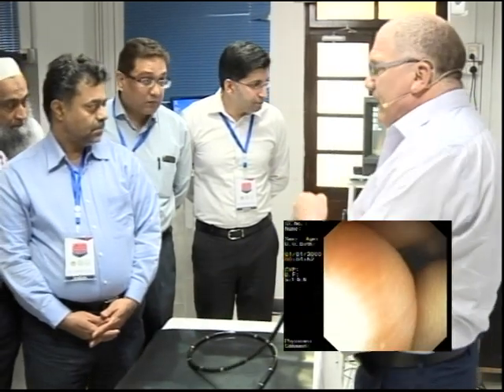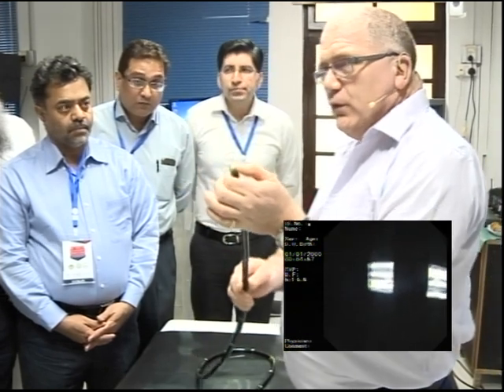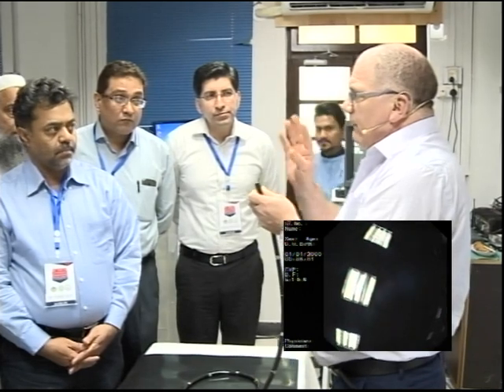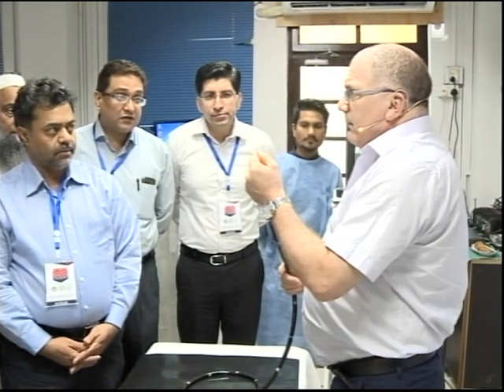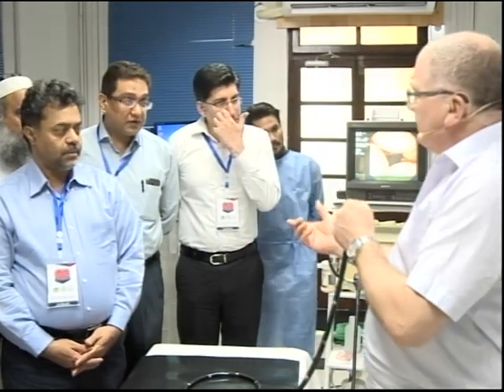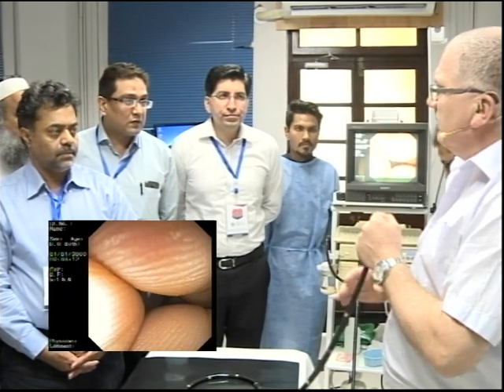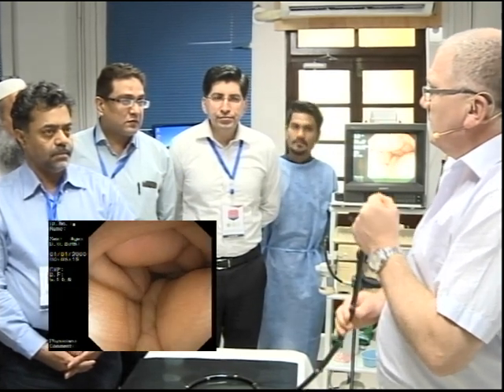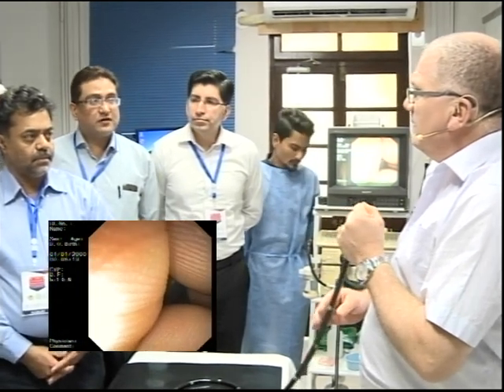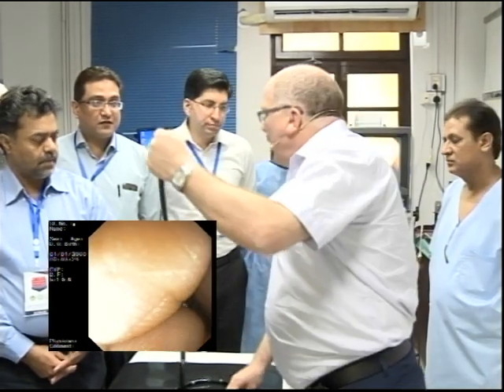On this system, with it being old, it's not doing what? What does your scope normally do in your units? Is it normally fixed light, or is it a flashing light? So it's fixed light, so you're on the older system. Flashing lights, why does it flash? Why is it doing this? Well, you think that the image is going to be better, but yes. Why is it flashing?